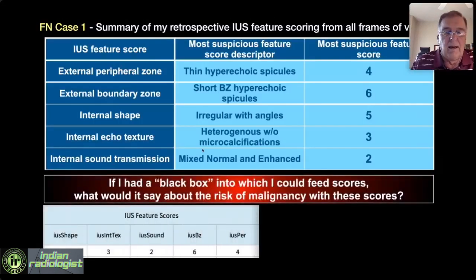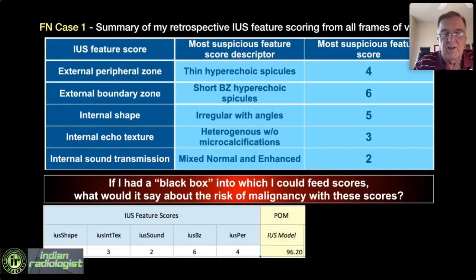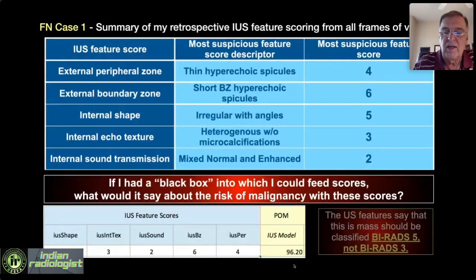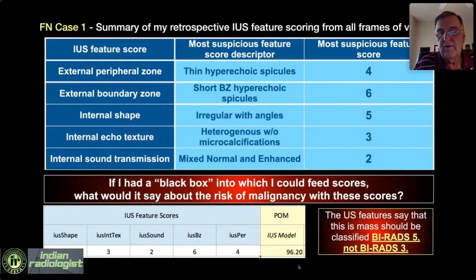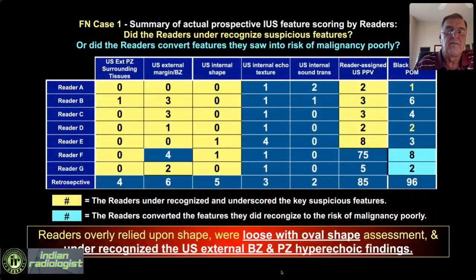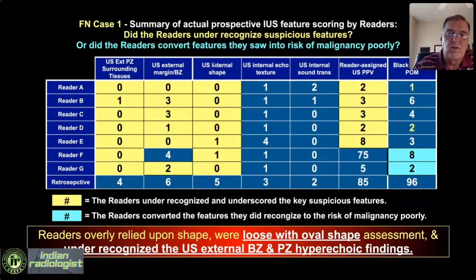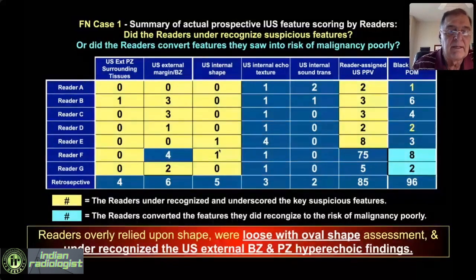If I plug this into my polynomial regression equation — where I can plug in these scores and predict the likelihood of malignancy — the likelihood of malignancy is 96%. Anything over 95% is BIRADS-5. So what was called BIRADS-3 by all the readers and myself is, in retrospect using the video and my regression equation, really a BIRADS-5. There is no way we should have called this BIRADS-3. Looking at the shape scores: 5 of the 7 readers called it flat oval, 2 called it plump oval — a gross overuse of the oval shape. I called it flat oval too, so I made the same mistake.